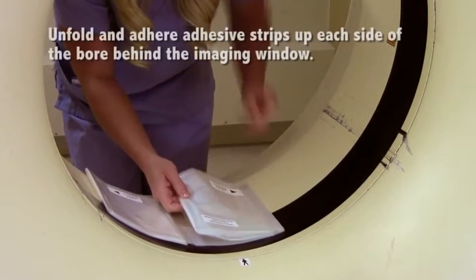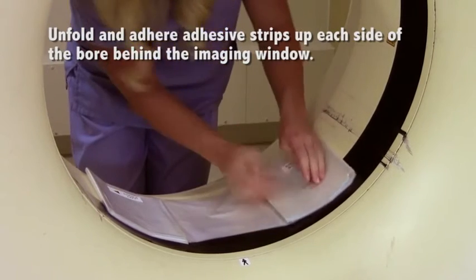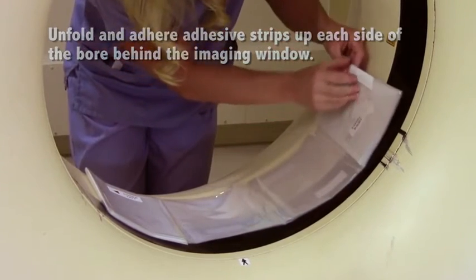Following printed labels, unfold and adhere additional adhesive strips up each side of the bore behind the imaging window.